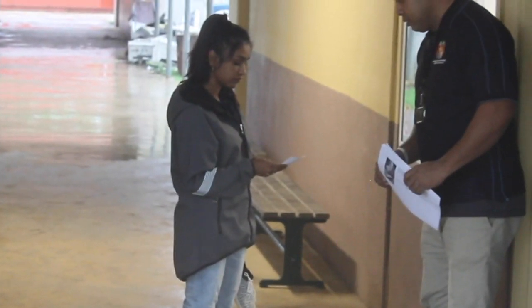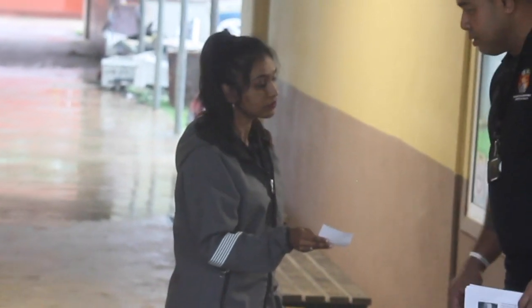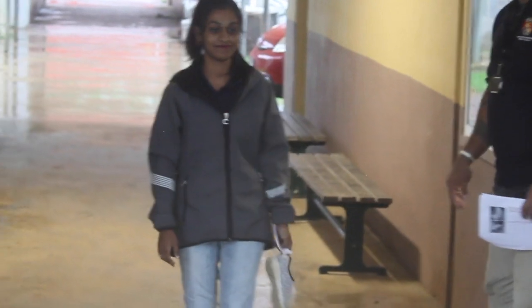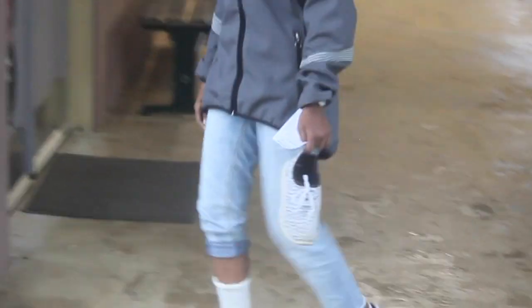Ask the person if they have any questions and offer to help provide further support. Book a follow-up appointment and provide an appointment card to the person. If the person notices any concerns or problems, advise them to return urgently for an appointment.